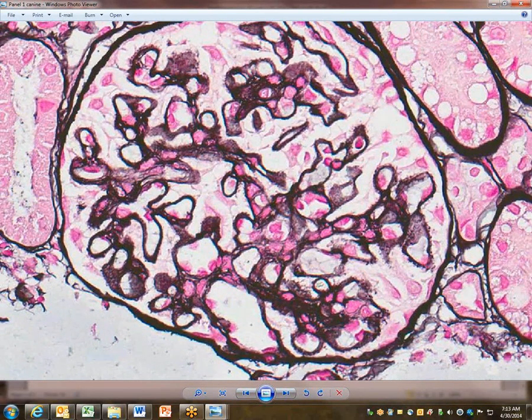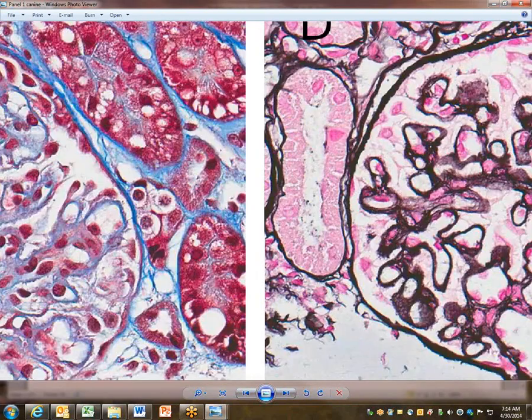Well, let's see here. I would suggest to you that this one, and especially out here for being so peripheral, they're a bit too thick. Okay. Yeah, I'm with you.